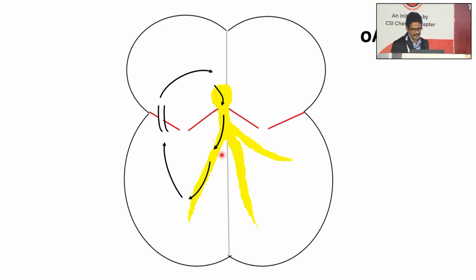In AVRT, the circuit is antegrade via the AV node and retrograde via the pathway. When you pace from the ventricle, it captures the ventricle, and via the accessory pathway it goes to the A and then comes down via the AV node to the His and the His-Purkinje system. Usually when you pace from the ventricle, the circuit gets attacked both by the orthodromic wavefront which goes along the circuit, and the paced wave can also go in the opposite direction of the circuit, which is called the antidromic wavefront. So this collision in AVRT can occur either in the ventricle, in the distal conduction system, or at the AV node level.